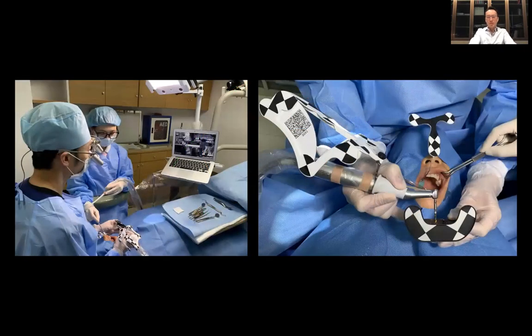So this is me operating on the system in the operating room. For the dynamic navigation system to work, this is the software installed in the computer. When I'm operating, I'm looking at the screen here, and on top here we see the light and the camera of the system. The first thing the camera needs to see is this jaw tag we attach to the patient's teeth.